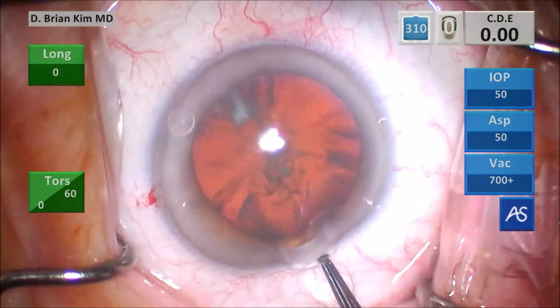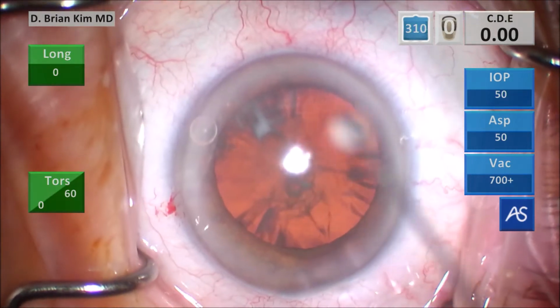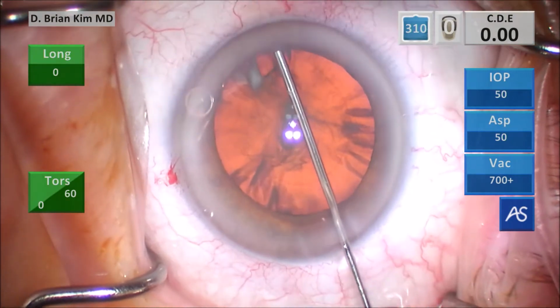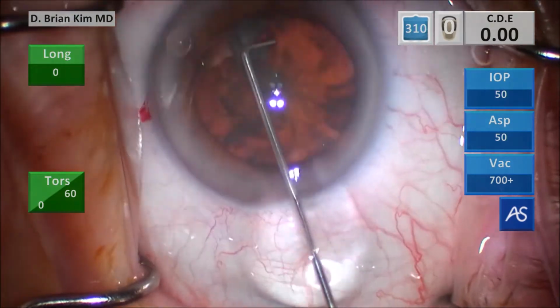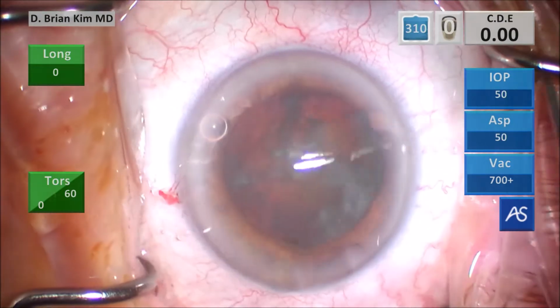Finish the rhexis, burp some viscoelastic out. This is the capsular fornix hydrodissection technique. I place a cannula under the rhexis edge contra-incisionally, get to the fornix, point the tip down, get a nice wave, rotate the tip back up, decompress on the left side, point the tip down on the right, and it hooks the lens and it spins quite easily there.